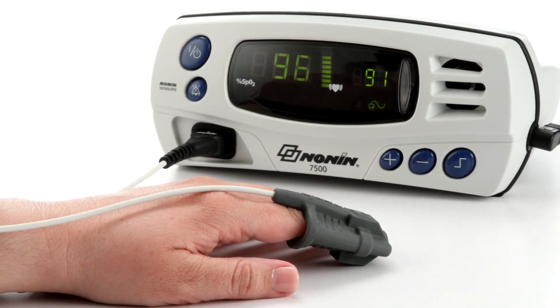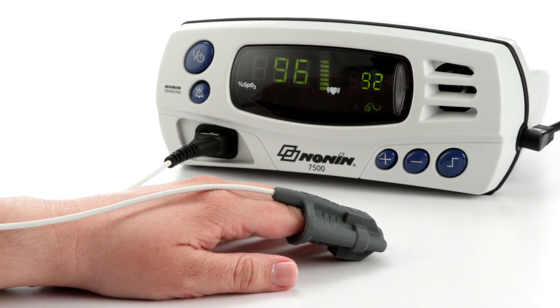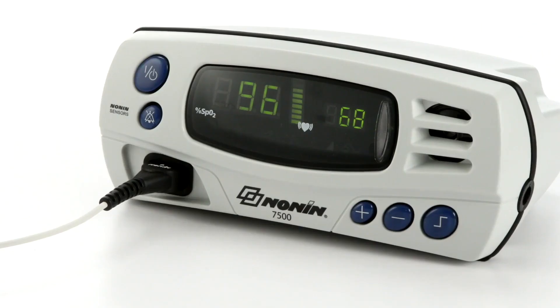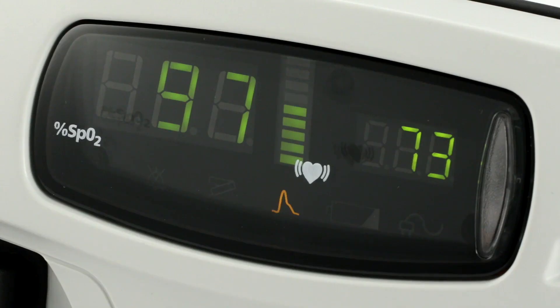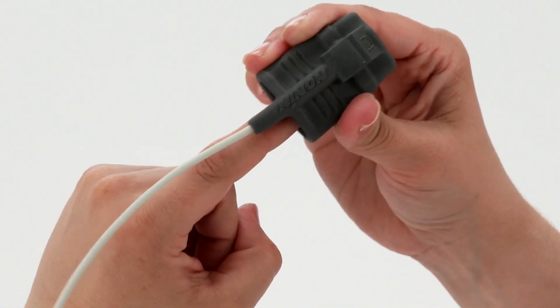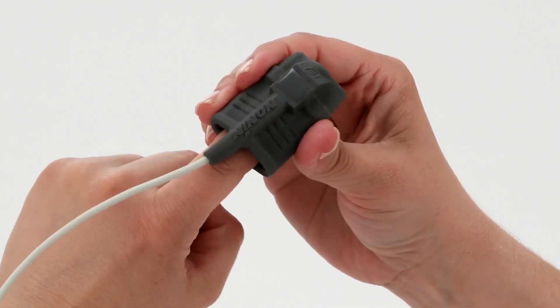After the startup sequence, the oximeter will start displaying and recording SpO2 and pulse rate as soon as the sensor is placed on the patient. The SpO2 level is shown on the left side and the pulse rate on the right side. The pulse strength signal bar in the center indicates the signal quality. Green bars indicate a strong pulse signal, amber indicates a marginal pulse signal, and red indicates a low pulse signal. It's a good idea to check pulse signal quality at startup and adjust the sensor for a stronger reading if necessary.